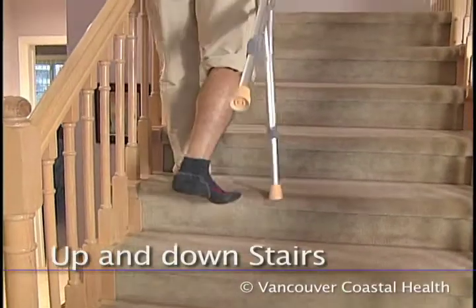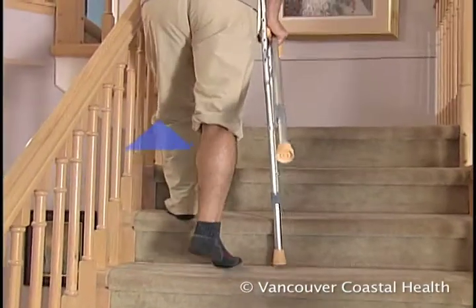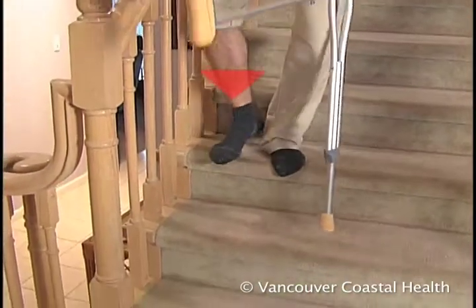A trick to remember how to correctly go up and down stairs is to think of the good or non-surgical leg going up to heaven and the bad or surgical leg going down to hell.